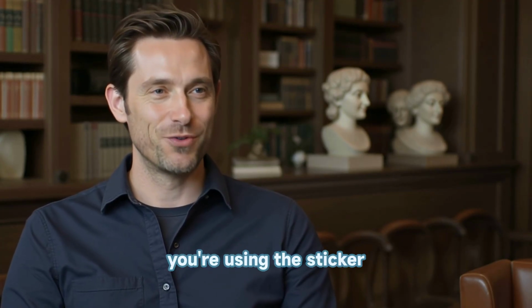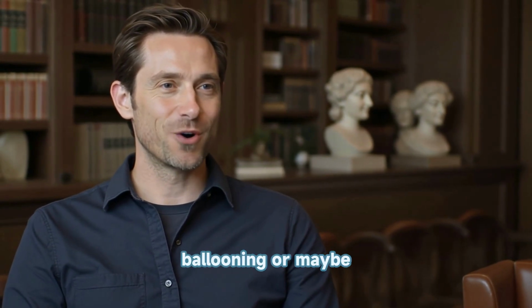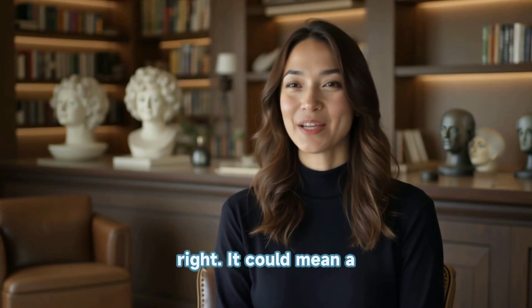Makes sense. But what if those things are happening? You know, you're using the sticker right, taking it off after showers, but you're still getting ballooning or maybe noticing smells? That's definitely a sign something's not quite right. It could mean a few things.